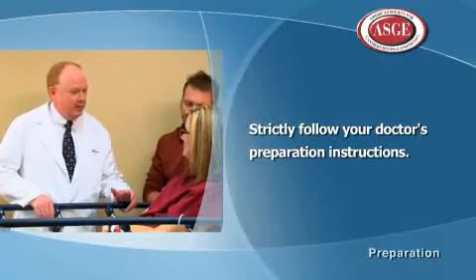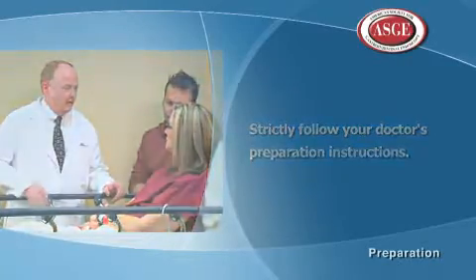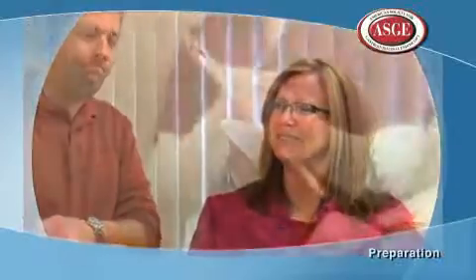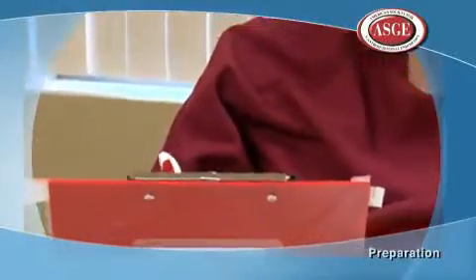This is so they can clearly see the upper GI tract to find any abnormalities and to avoid having the procedure canceled. Your doctor will also need to know what medications you are taking before your endoscopic procedure. You may be asked to stop some of those medications in advance of the exam. Before the procedure, the medical staff will provide you with an informed consent document to sign. This document discusses the risks, benefits, and alternatives of the procedure.